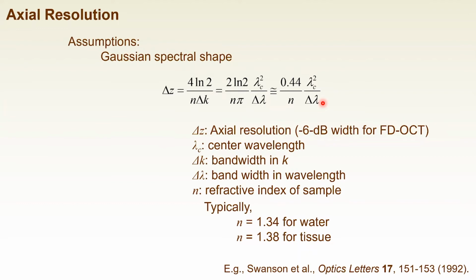And for some reasons, for the short wavelength, in most cases we use the spectral domain OCT configuration. Okay, and recently some of you already know about visible light OCT. Recently there is emerging development of visible light OCT, and it is specially utilized for high resolution imaging. And the reason is that visible light even more easily gives us very high resolution than 840 near infrared. Okay, visible light can more easily give us a higher depth resolution than the near infrared light.